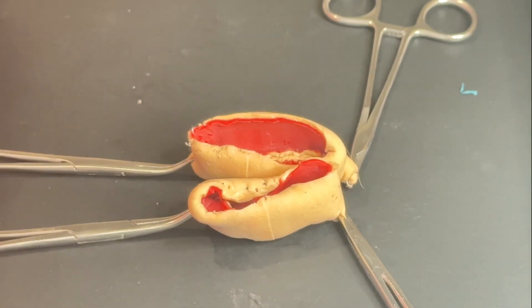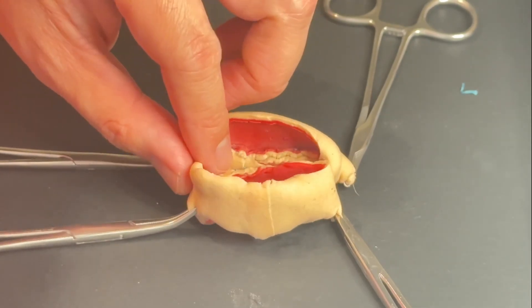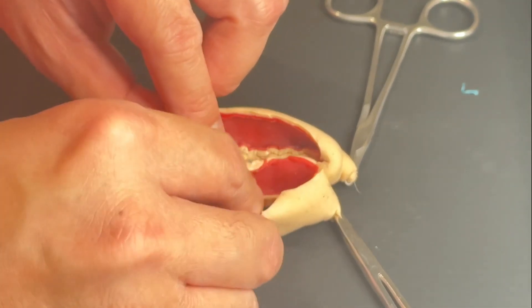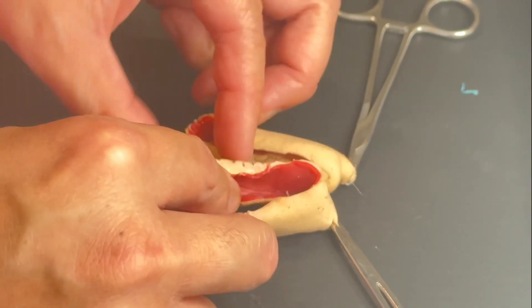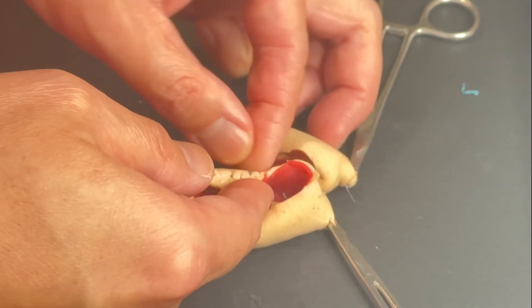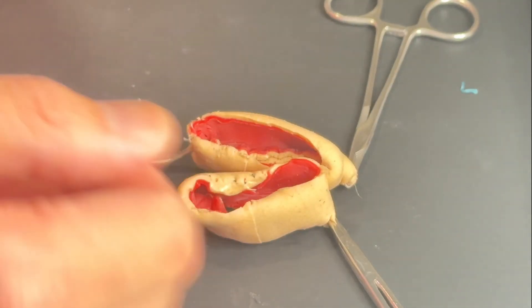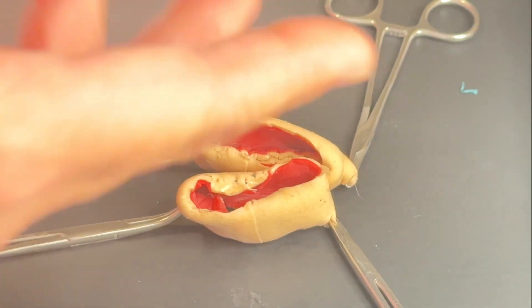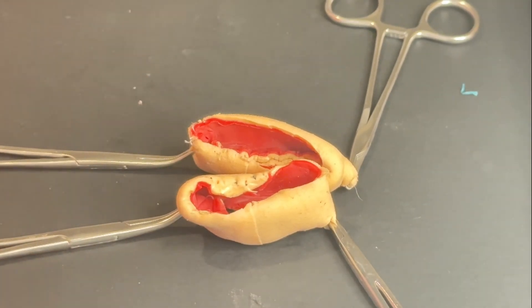Today we have a simulation of a bowel. I used this more than a decade ago to practice, and it's actually a really good simulation because you can see the two layers present, which simulate the mucosa and the serosa. You do have other layers normally, but for suturing technique, this is something super important that can actually help you get better by practicing.